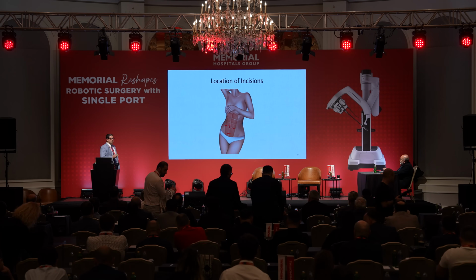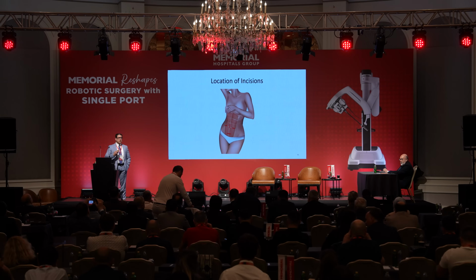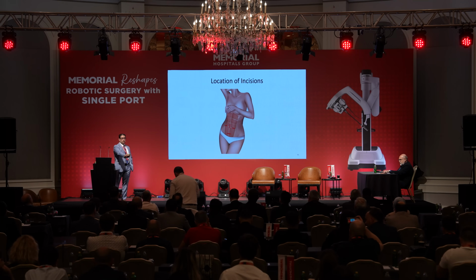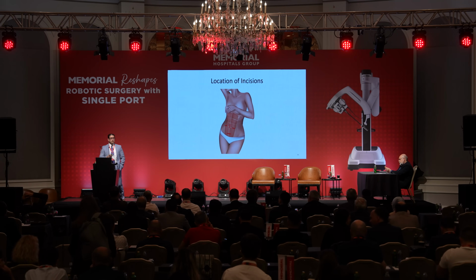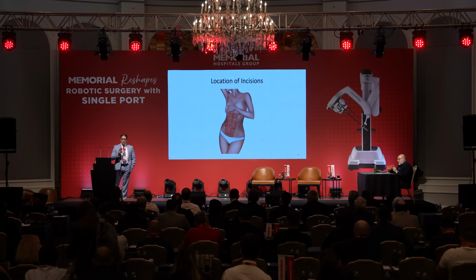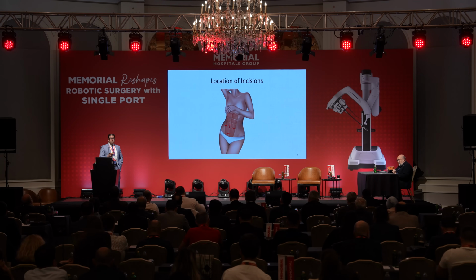The good thing about the SP is that you can put it anywhere you want, as long as you understand that you have 10 to 25 centimeter extension and retraction. You can put it above the surgical field, opposite the surgical field, or in the middle, which is a good characteristic for the SP, but you need to know how to operate the SP in order to be able to do it from anywhere.